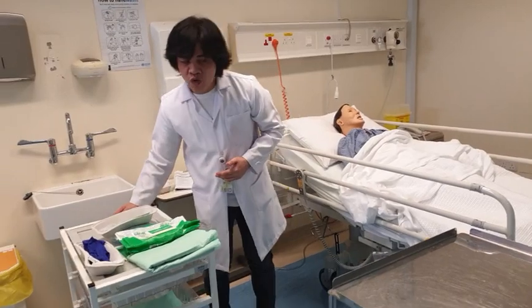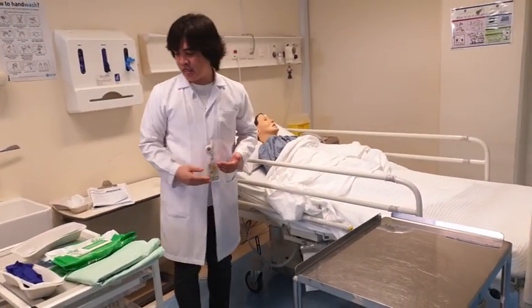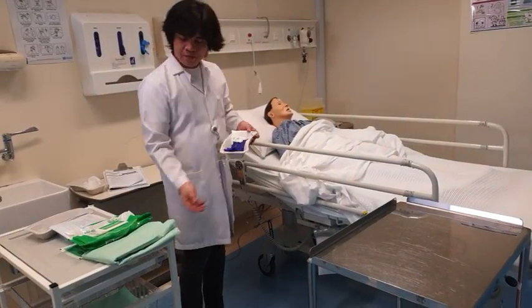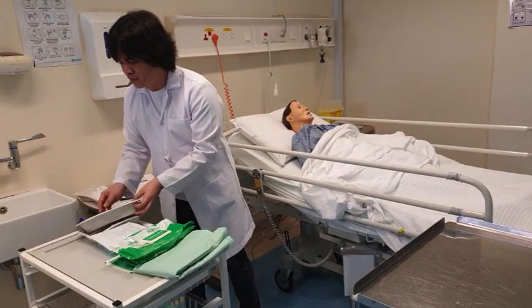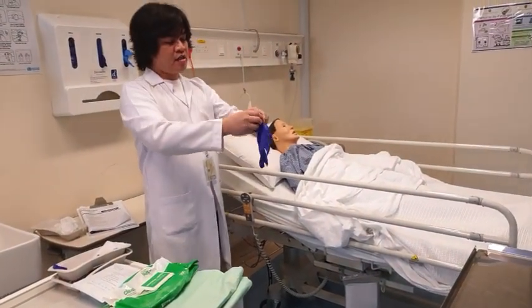The first thing that we're going to do is to remove the old dressing from our patient. So, put on your clean gloves.